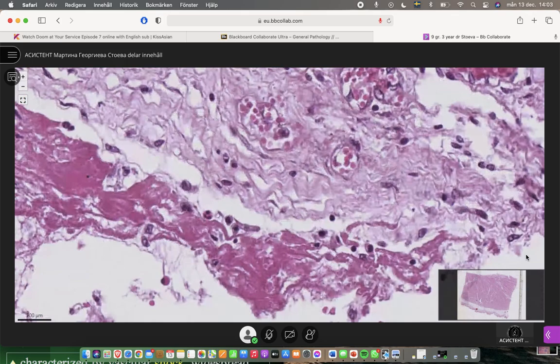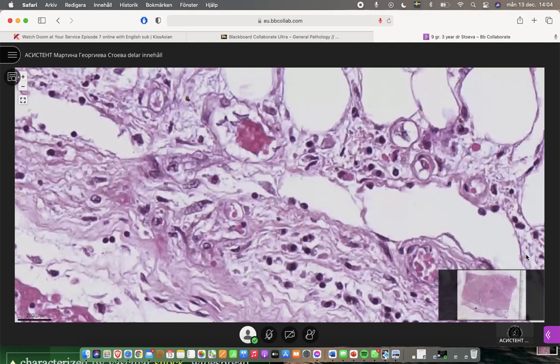Some of the inflammatory cells are neutrophils. Unfortunately, honestly, on this slide, we can find mainly mononuclear cells. You know that fibrinous inflammation is an example for acute inflammation. It's a type of acute inflammation. So usually in between the fibrin strands, we expect to see neutrophils.